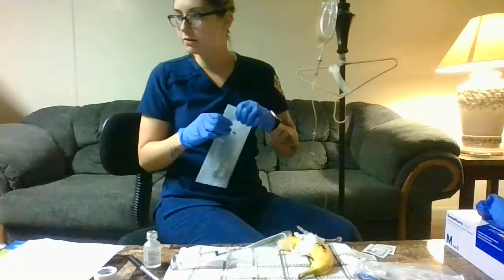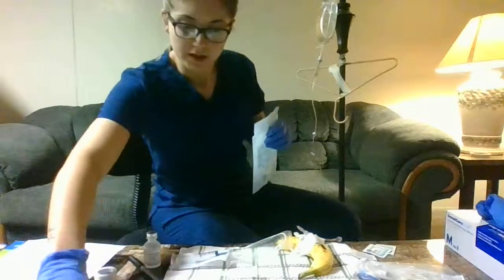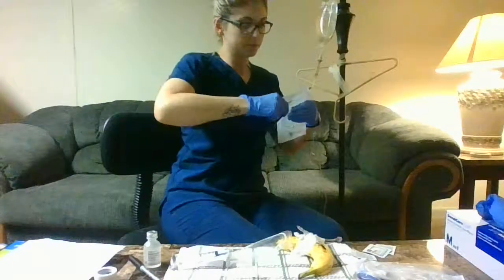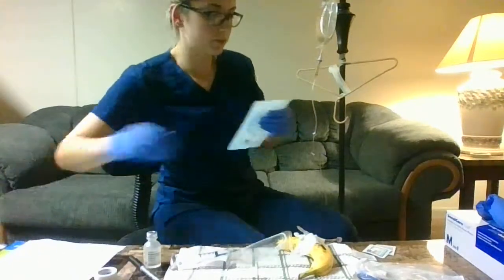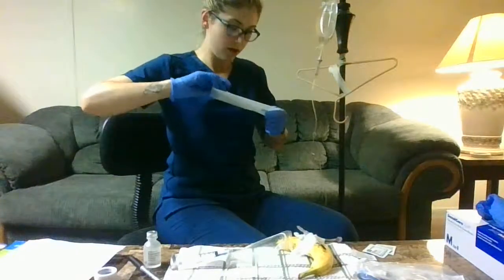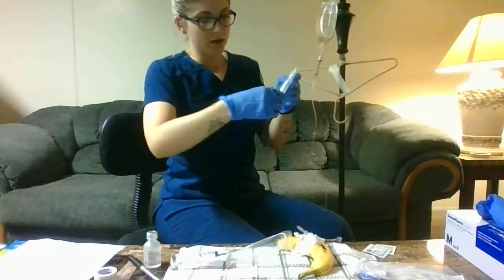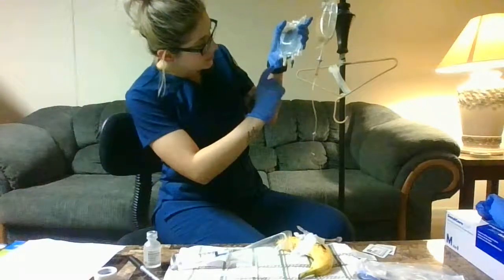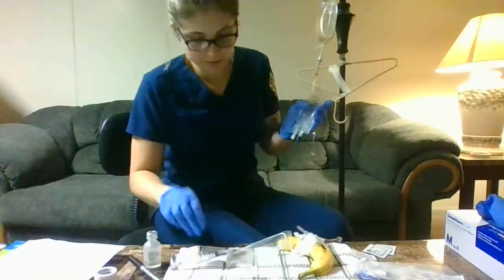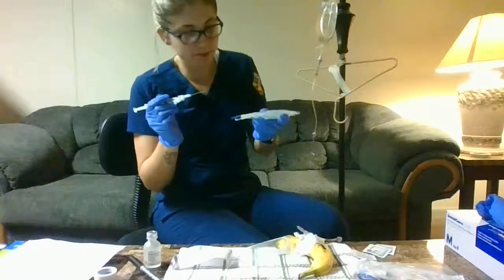We are going to get this opened. So there is the medication port right there. And then you want to be careful.